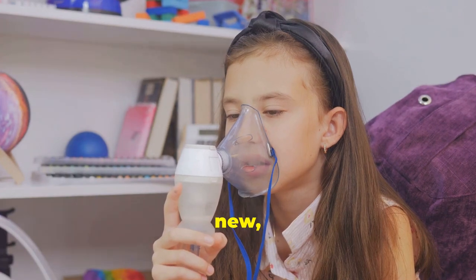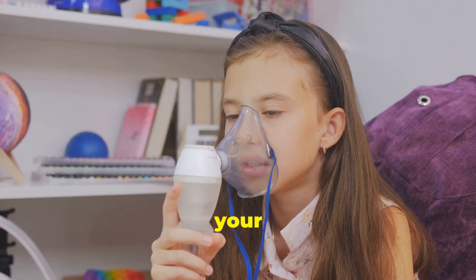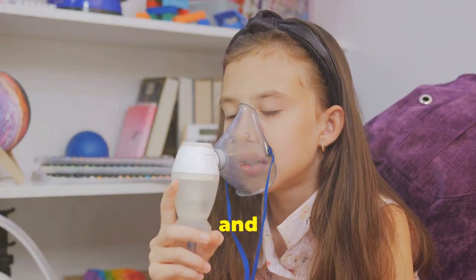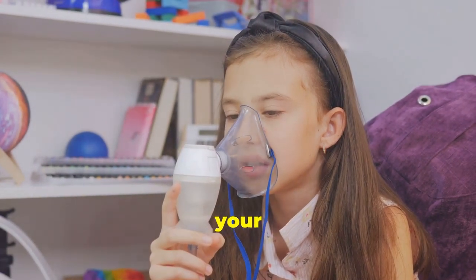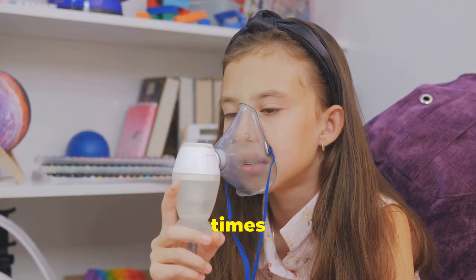If your inhaler is new, it must be primed before first use and in periods of non-use. To prime your inhaler, remove your cap and check for foreign objects. Shake your inhaler for 10 seconds and spray away from your face, repeating as many times as recommended.